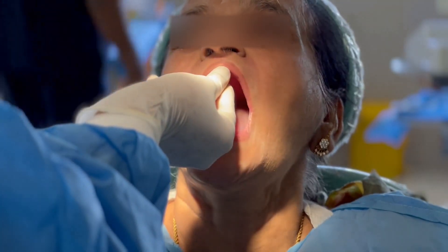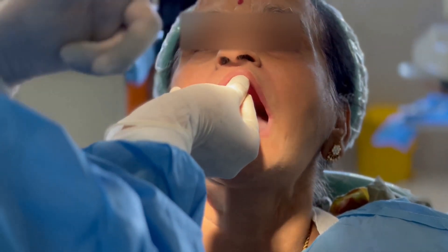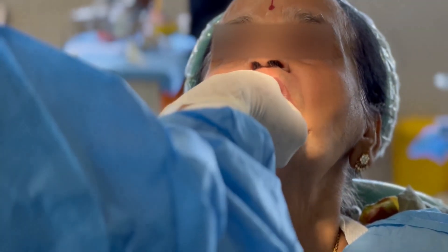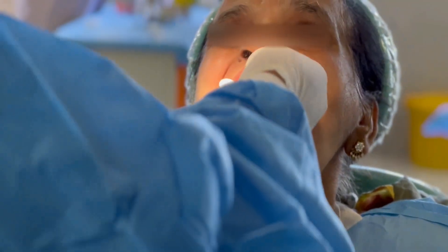Opening the mouth wide delineates the depth and width of the distobuccal flange as governed by the muscle attachments, while moving the mandible from side to side accommodates for the movement of the coronoid process.